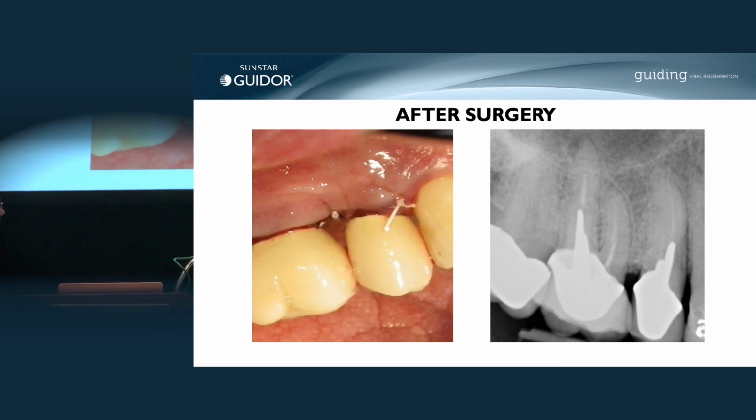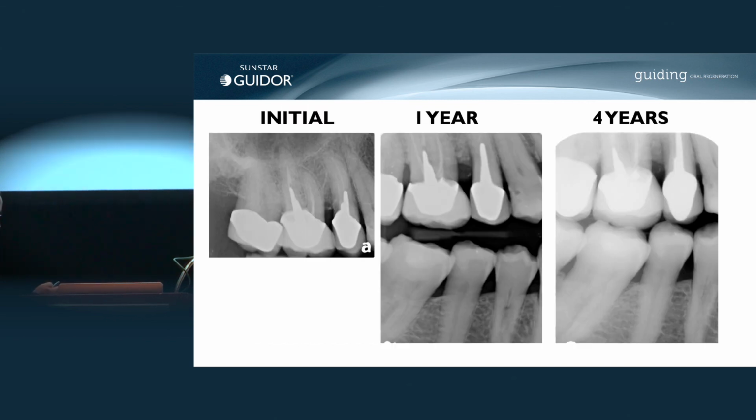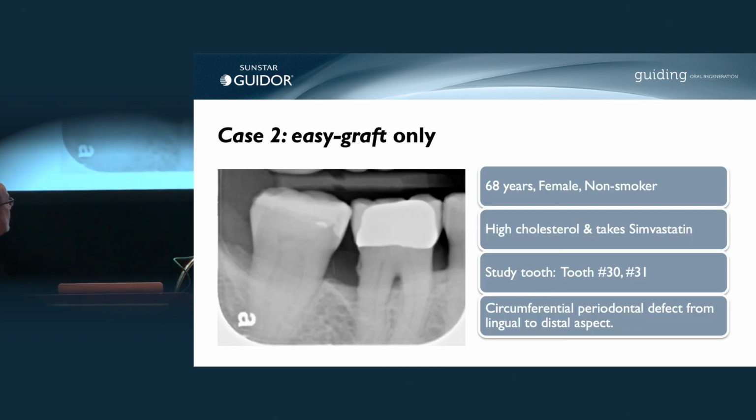In none of my periodontal cases have I used a membrane, but it's really easy to use in those cases. Here I have initially the defect, and then at 1 year, and then at 4 years. So it has maintained the amount of bone in a periodontal defect.